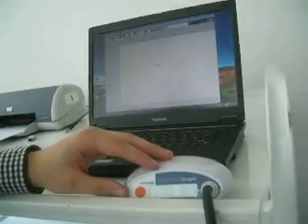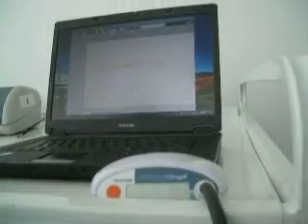Now that was the end of the first phase. Now the blood pressure values are obtained, and according to the obtained values, two different pressure steps will be performed. The first is the so-called diastolic pressure level. So this is one phase where some of the arterial function parameters are obtained from, and now this is one of the most important steps, if not the most important.